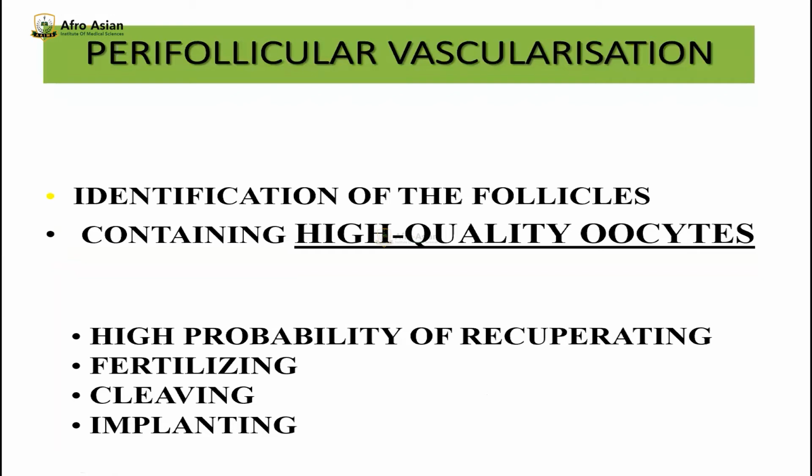Identification of the follicle containing high quality oocytes, with a high probability of recuperating, fertilizing, cleaving, and implanting.